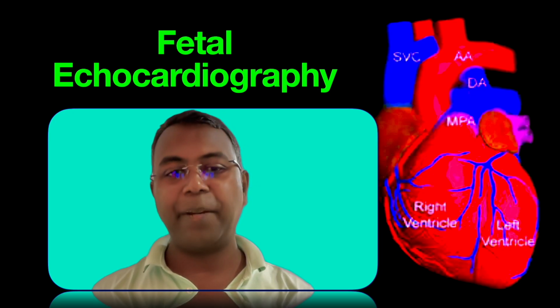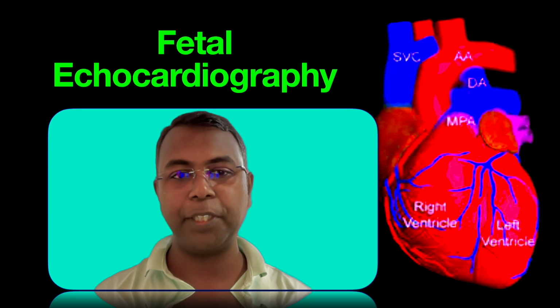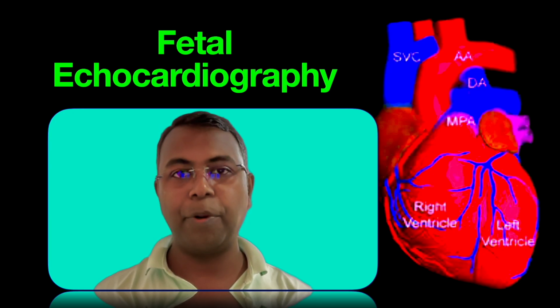It's been a long time I wanted to speak on a topic called fetal echocardiography, which is very close to the heart of every fetal medicine specialist, radiologist, and sonographer who are practicing fetal ultrasounds.